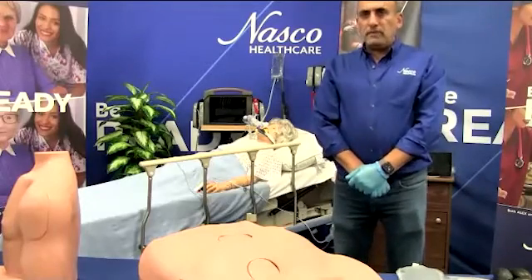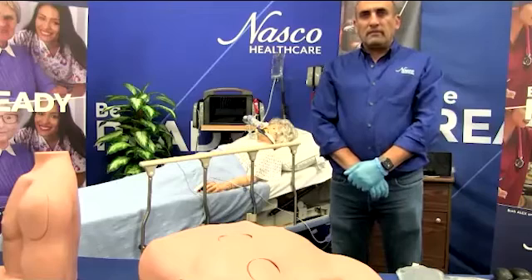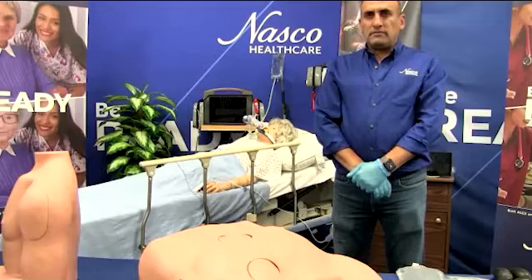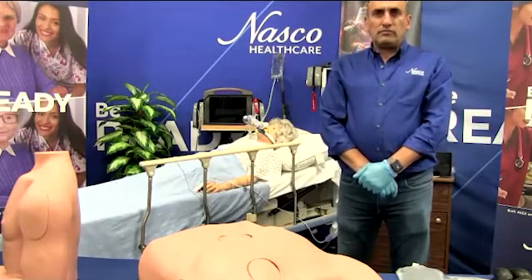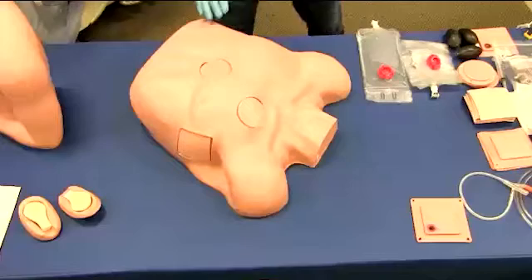The other question is: does this trainer come in multiple skin tones or gender options? At this time, we only offer a light skin tone with male features.